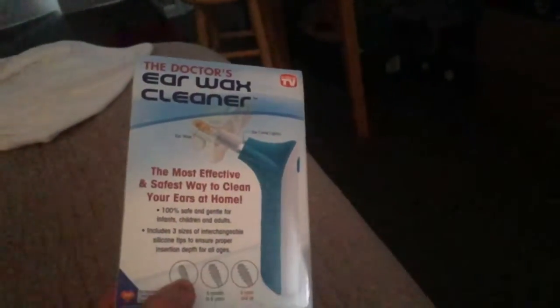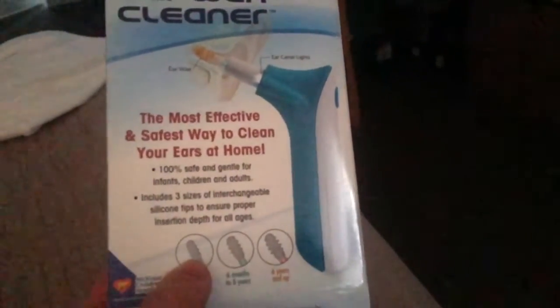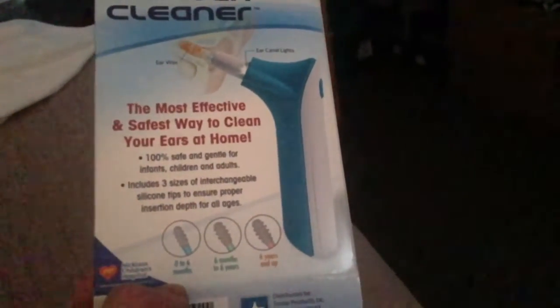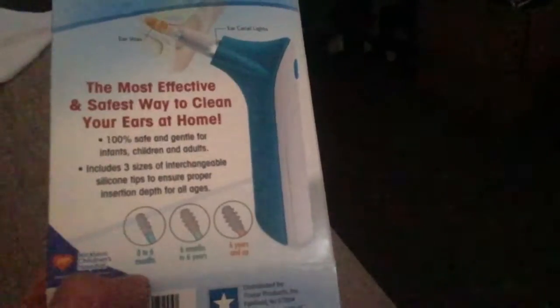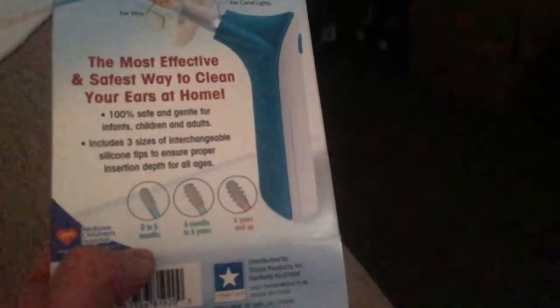The doctor's earwax cleaner — the most effective, safest way to clean your ears at home. It's 100% safe and gentle for infants, children, and adults. Includes 3 size interchangeable silicone tips to ensure proper insertion for all ages.